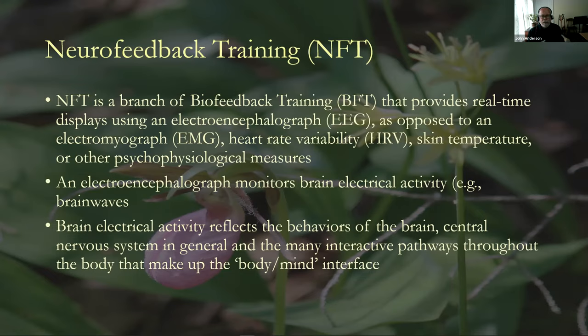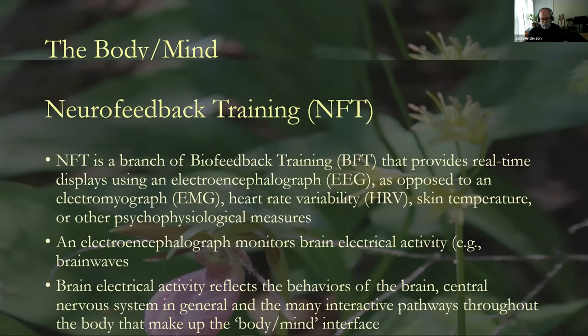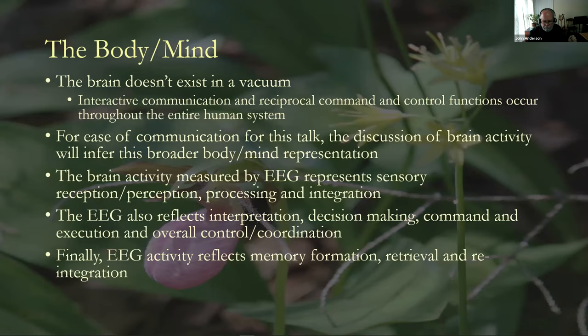Working with the EEG, the brain directly, we're looking at the electrical activity, which reflects the behaviors of the brain, the central nervous system, the nervous system in general, the many interactive pathways throughout the body that make up the body-mind interface. So one of the things that's helpful is the EEG can give us information about so many different factors in the system.